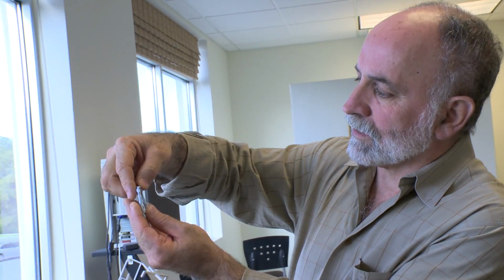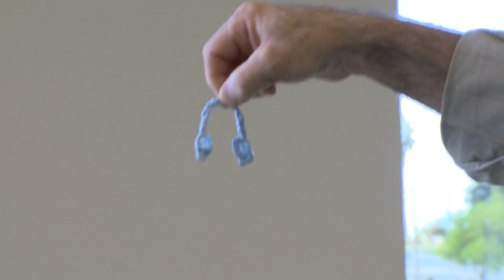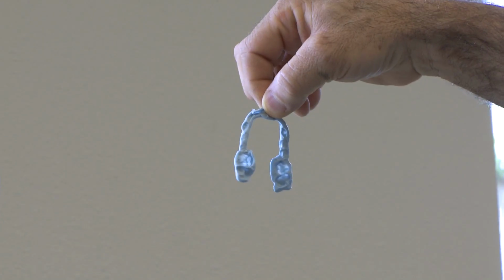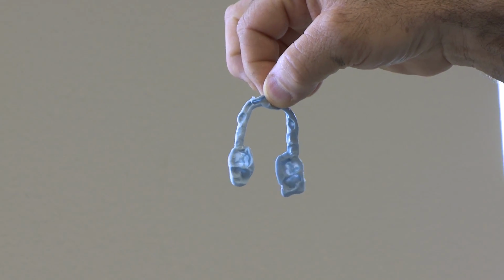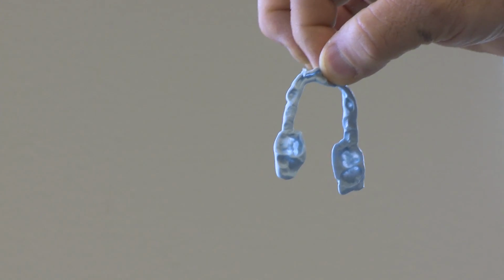Hold it up for the camera, in front of this white wall panel, right there. Perfect. This is like a pressure gauge. It shows us in thousandths of an inch how everything's touching. So we can see more light coming through parts. That's where my teeth are hitting right now.